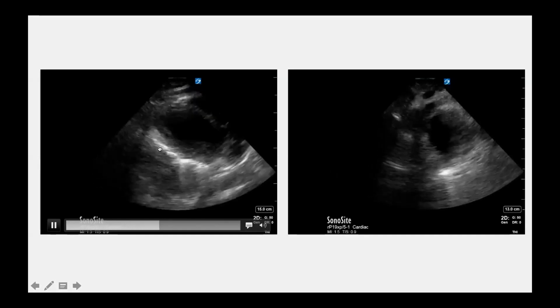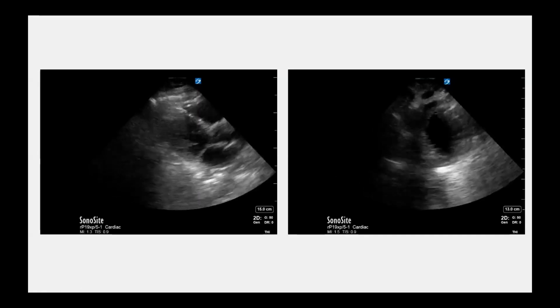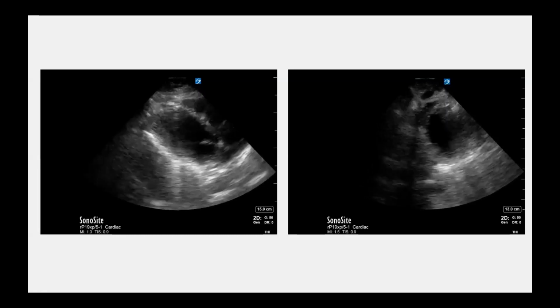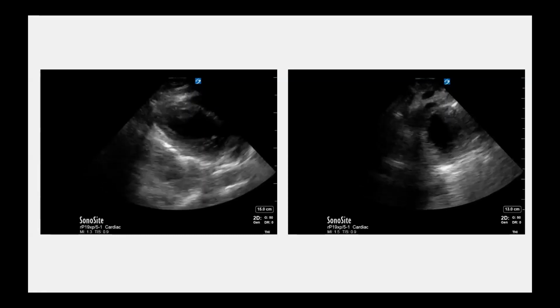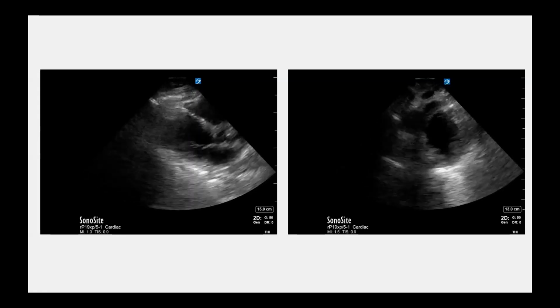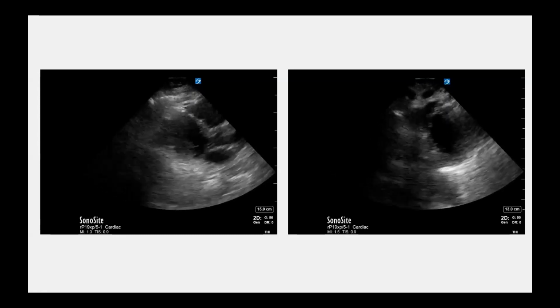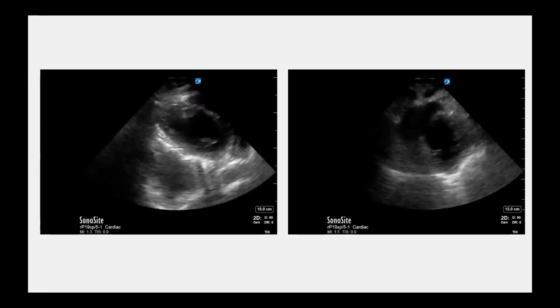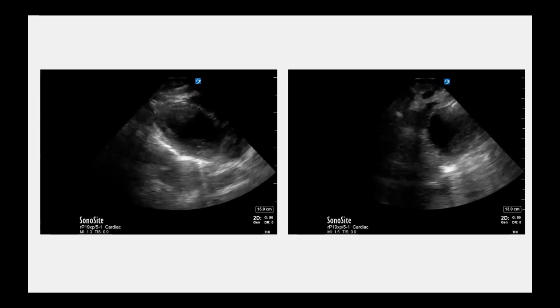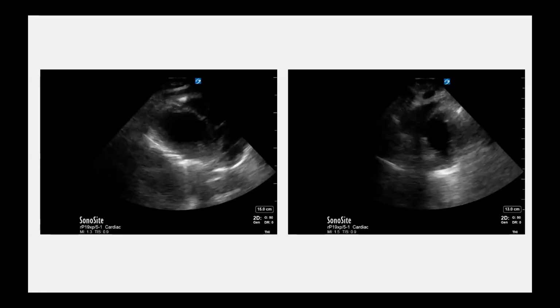It kind of moves in concert with cardiac motion, and normally you see the effusion in the dependent areas as well. So if you're evaluating for an effusion, where are you going to be looking for an effusion in this image, parasternal long axis? So where specifically? The descending aorta. We will look at the aorta. If the effusion is a little bit proximal to the aorta, it's a pericardial effusion, and if it's distal to it, then it's a pleural effusion.